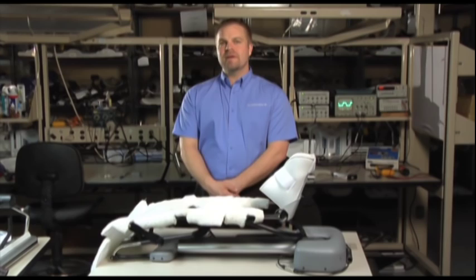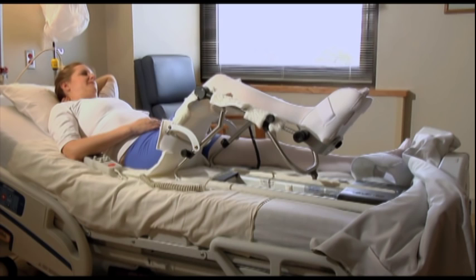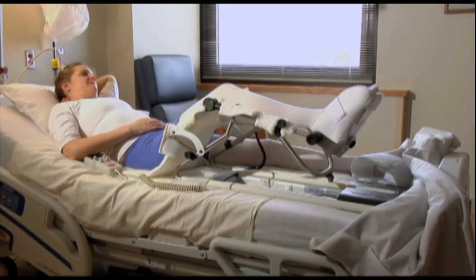When you place a patient's leg in a CPM machine, you not only elevate it but also passively move the repair joint. The combined effects of the elevation and the gentle motion help to pump the swelling out of the knee.